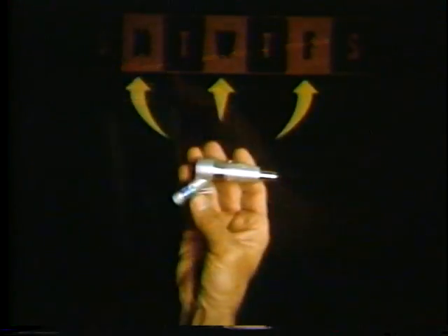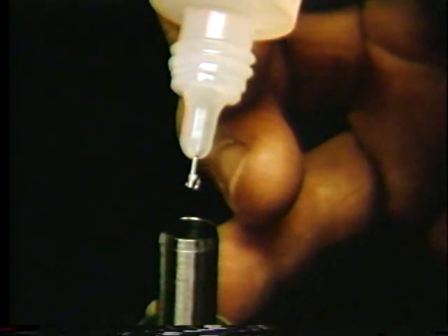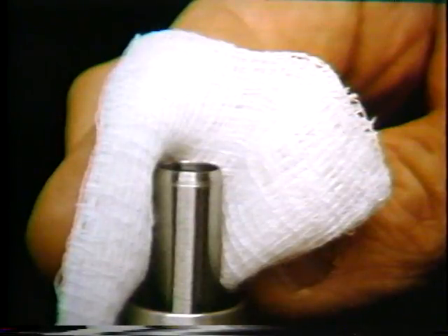For normal use, the shorty motor should be cleaned and lubricated twice a week, on Monday and again on Wednesday. If you're going to use the handpiece on the weekend, it should also be lubricated on Friday. Place 2 drops of the True Torque conditioner in the nose of the air motor. Then clean the outer surface of the nose with a 2x2 alcohol sponge.